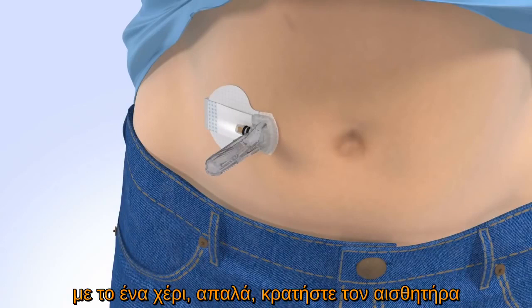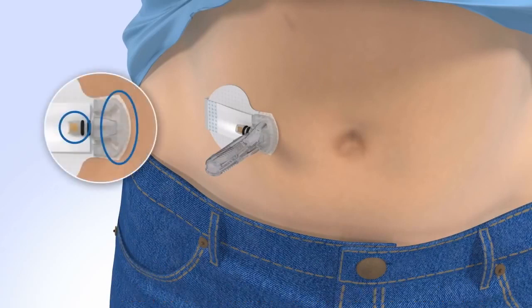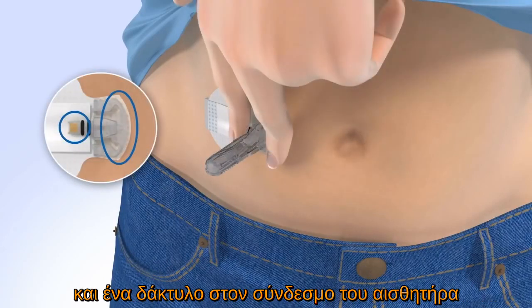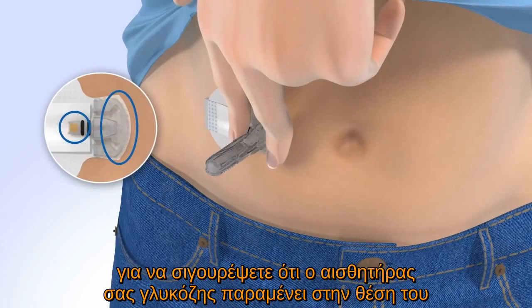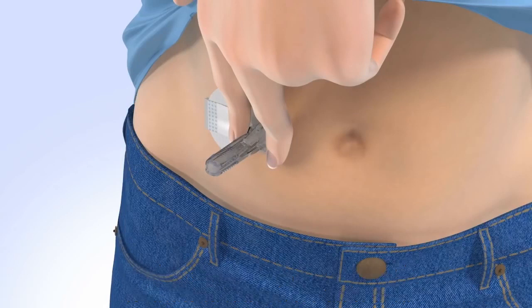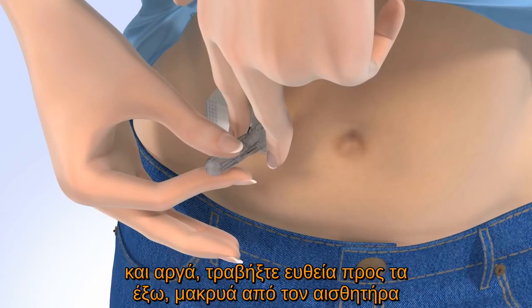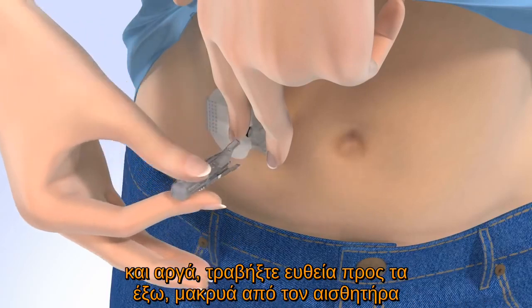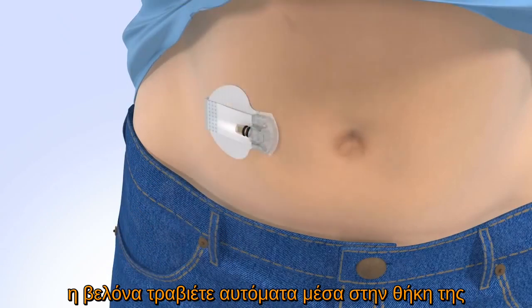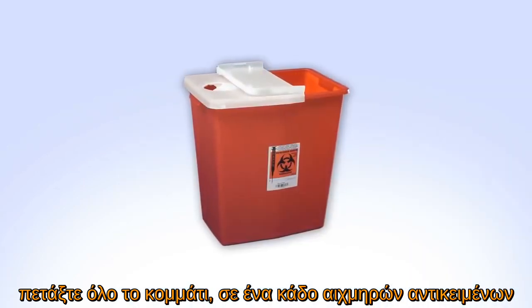With one hand, gently hold the sensor by placing one finger on the front of the sensor and one finger on the sensor connector to ensure your glucose sensor stays in place. Be sure you do not hold or pinch the sides of the sensor. With the other hand, hold the needle housing at the tip and slowly pull straight out away from the sensor. The needle automatically retracts inside the plastic needle housing. Discard the entire piece into a sharps container.